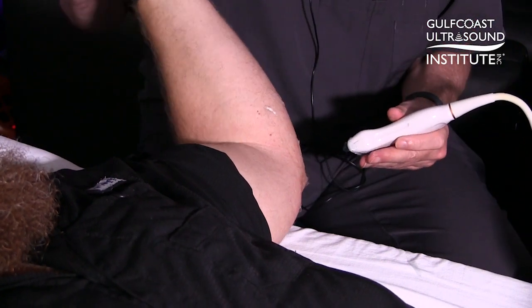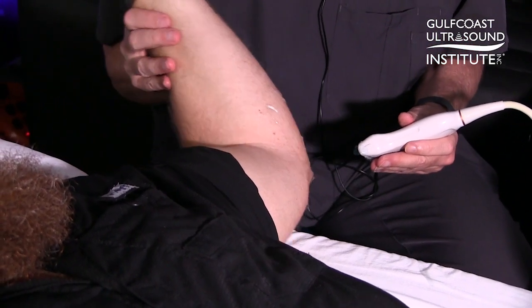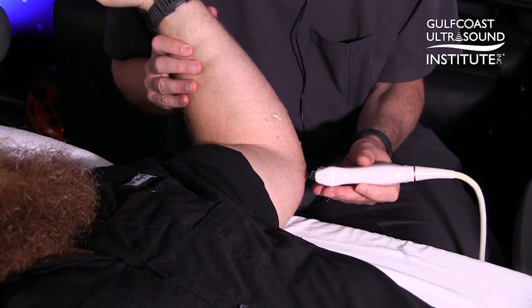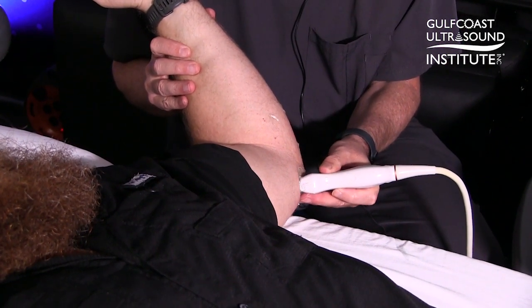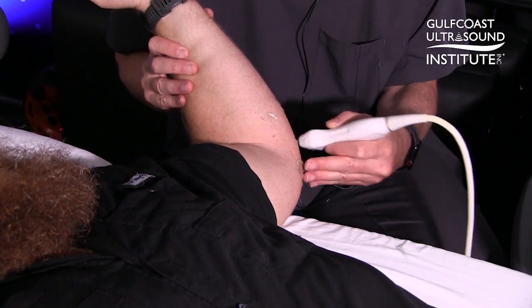To do this, we usually want to be in a flexed position. We have to be careful if they happen to have shoulder issues too, how much we externally rotate the shoulder when we do this position. It's nice when we do a cross-sectional measurement of the ulnar nerve to line up the medial epicondyle and the olecranon.